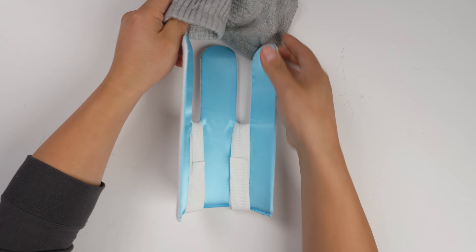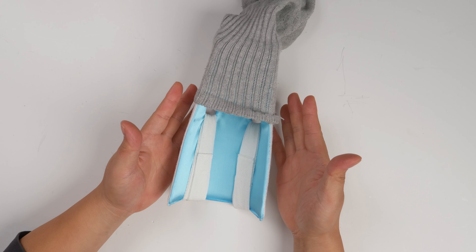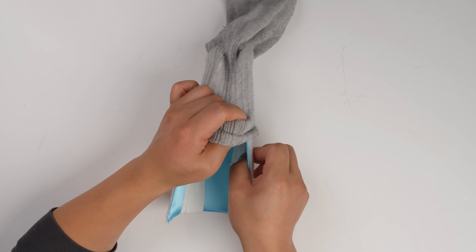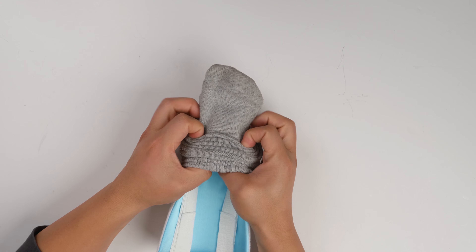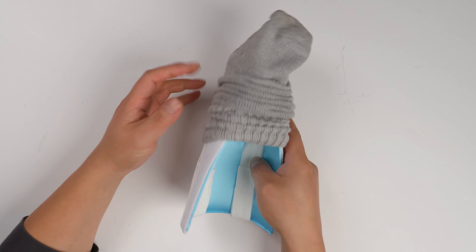I got a sock. This sock is super long, and actually this one's pretty big. So if the sock is very small, you're going to squeeze it like this. I think it's better to put it all the way up, just like this.